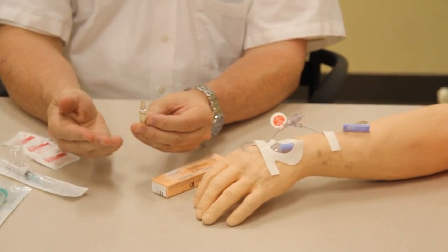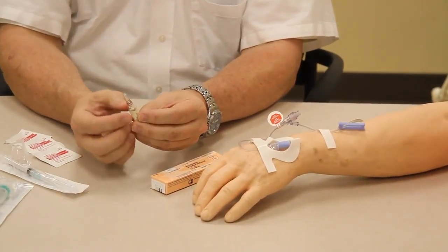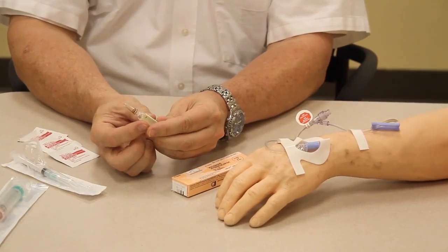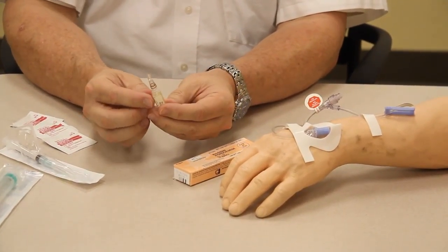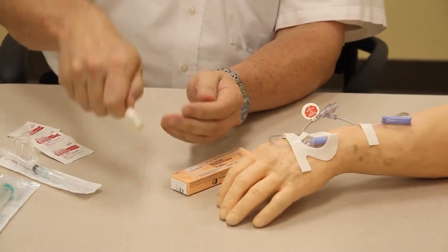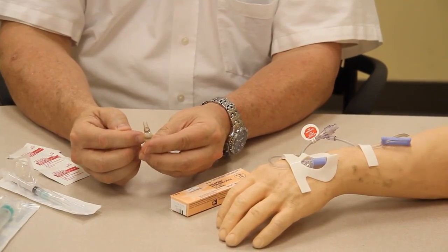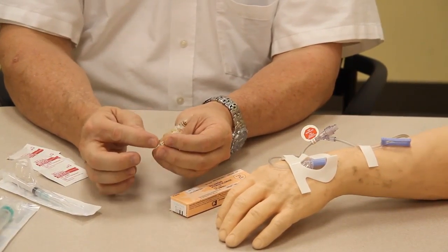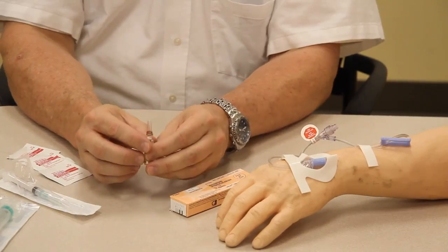There are 2 different ways that you can get that medication out. The first is just by tapping, and you can see now that there's no medication in that vial. The second is that when we have this like this, we can literally roll over the vial like this, and all the medication has gone down to the bottom. Again, we want to make sure that we have our full 2 milliliters in this part of the vial.